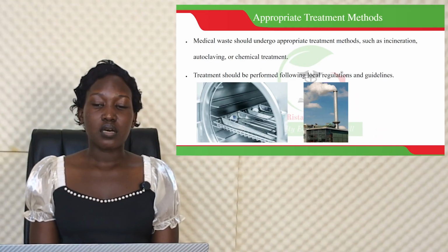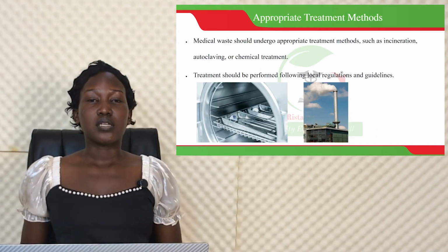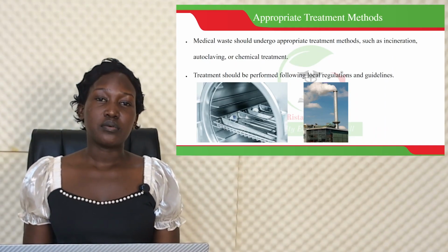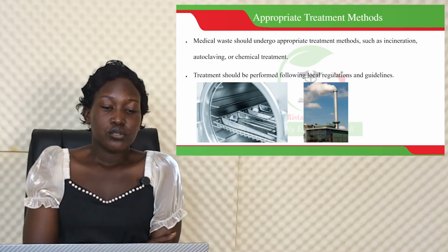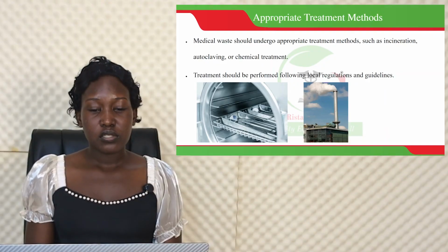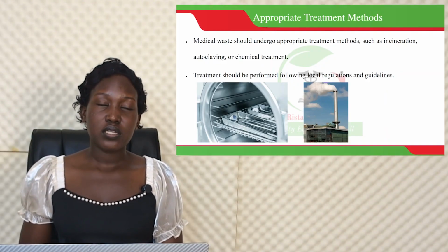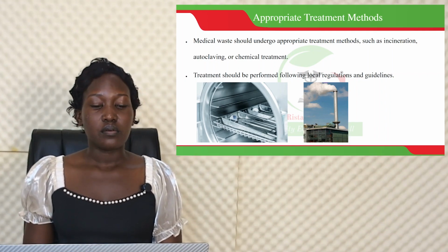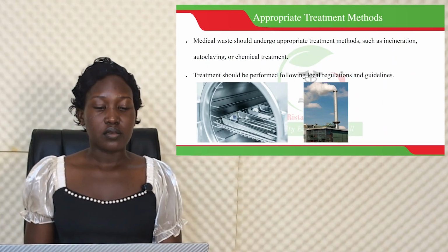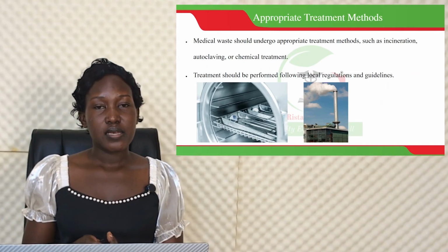Others can be put in the incinerator, others can be put in chemical treatment, especially the ones which are highly infectious. So treatment should be performed following local regulations and guidelines. As we can see from the picture there, we have an incinerator and an autoclave. So in the autoclaves, most times they are sterilizing.